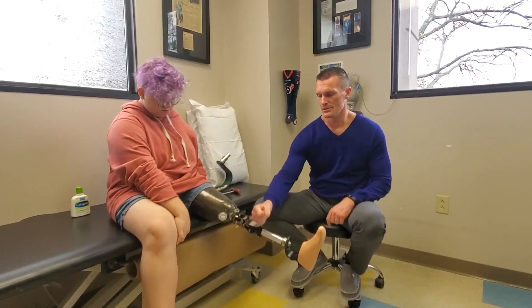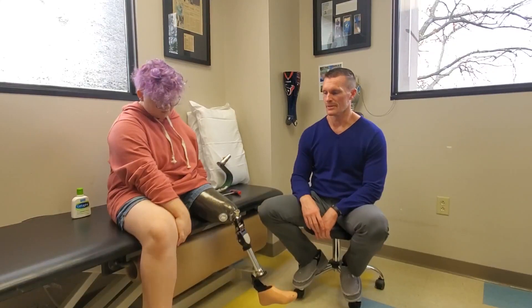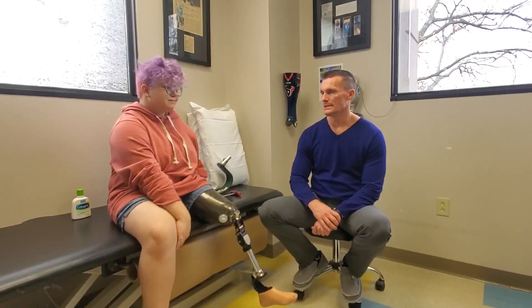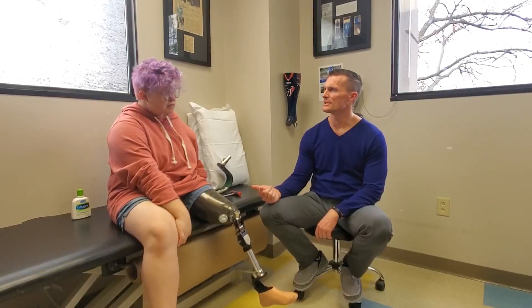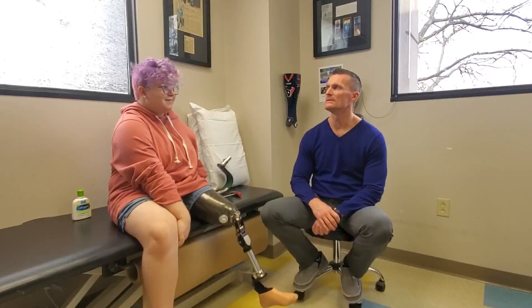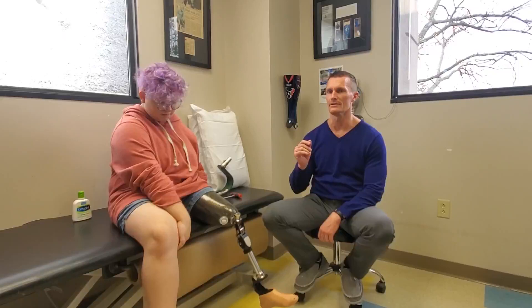So what we're changing to now is going into adult components for her, because the last couple of knees she's kind of torn them up. The other issue we run into — what's your big complaint when you leave early to go to lunch or the next class? It's loud. Yeah, the knee. She would leave a little early, walking down the hall by herself, and a broken knee is really clang, clang, clang, clang.